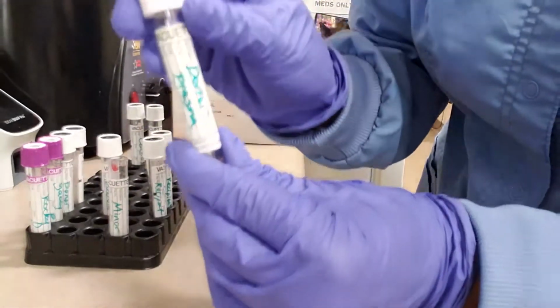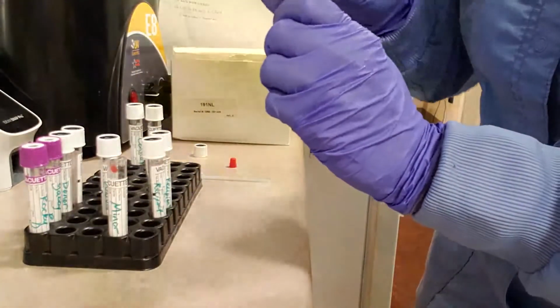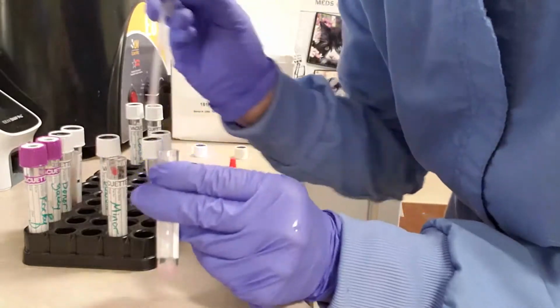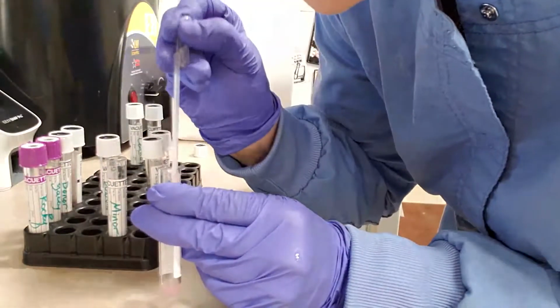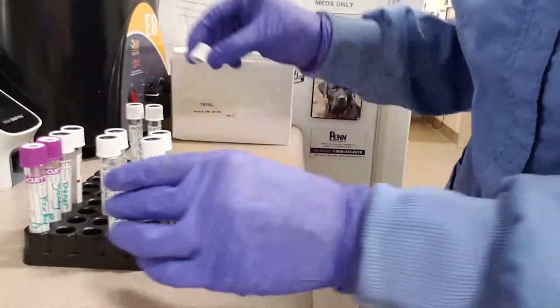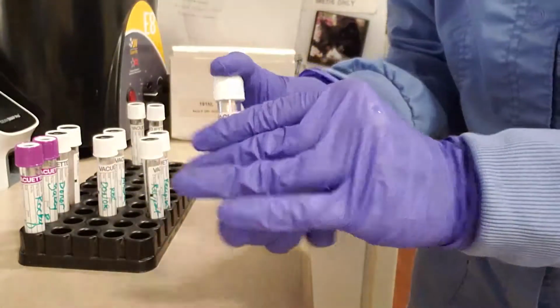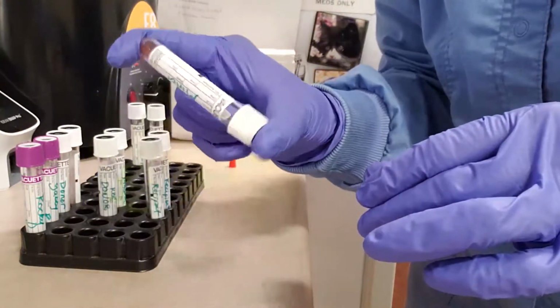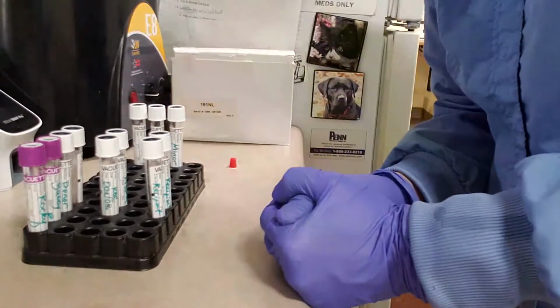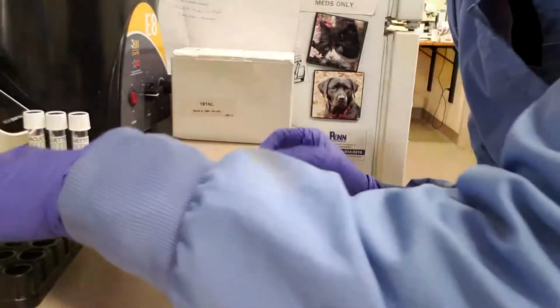And we will do that with our donor plasma. This will be 2 parts: 2 drops of plasma for 1 drop of red blood cells. 1, 2. Okay. And again, mix it just very gently. And now we will incubate at room temperature, and then we'll be ready to centrifuge and then to examine it. So we'll let it incubate for 15 minutes.